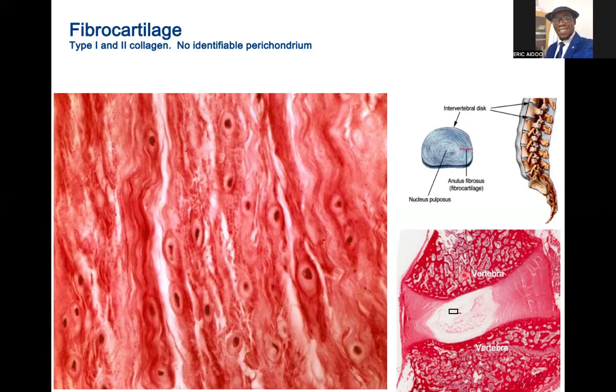So this is the vertebra, and in between the two vertebrae you have the intervertebral disc. So this was the annular structure I was referring to earlier on. That concentric layer is a fibrocartilage which is able to cushion one vertebra from the other, so that the two bones do not meet and then cause a lot of friction and wear and tear. So you have this intervertebral disc in between them. The nucleus pulposus is actually a remnant of the notochord.